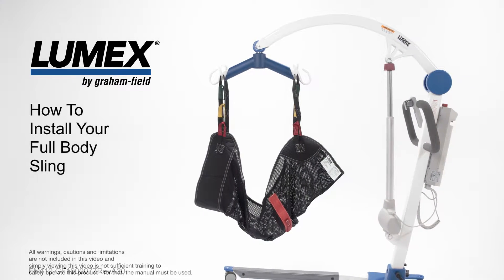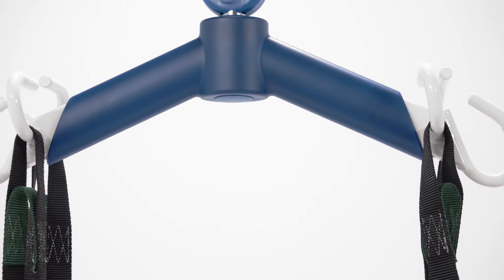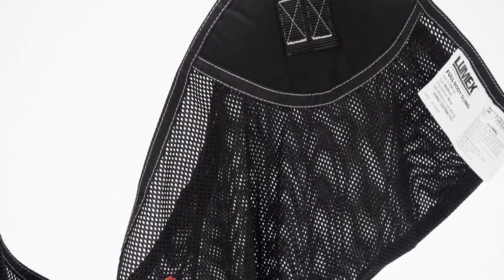Hello, I would like to introduce you to the Lumex line of full-body slings. Lumex slings are proudly manufactured in the USA. Lumex full-body slings are easy to install and are available in solid or quick-draining mesh, depending on your needs.